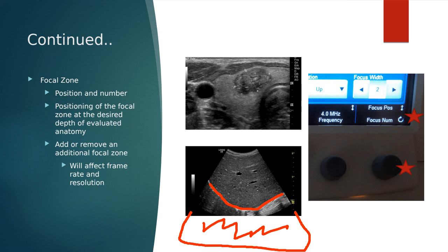And then my focus is saying, okay, I'm trying to show you that posterior border. I'm trying to bring your attention to this and send the most amount of strong energy to this level of that posterior border. So I'm going to set my focus right here, right at the level of where that posterior border is.